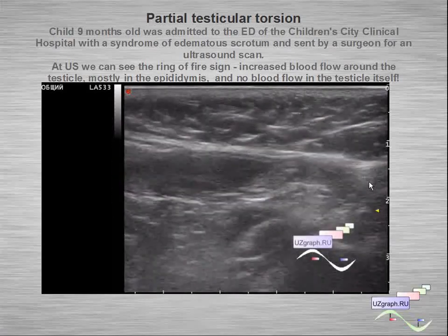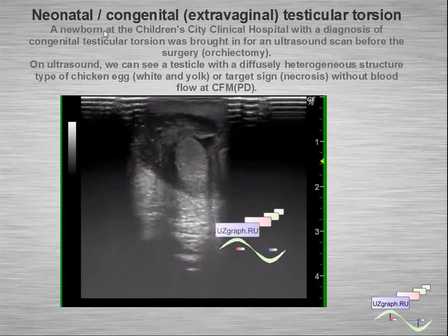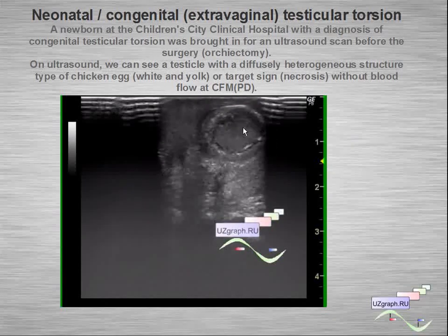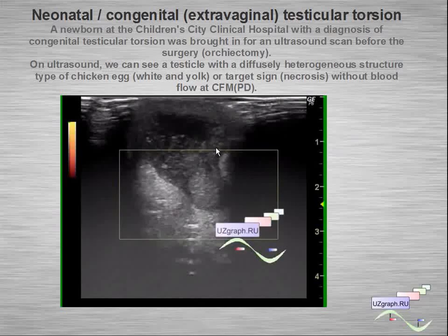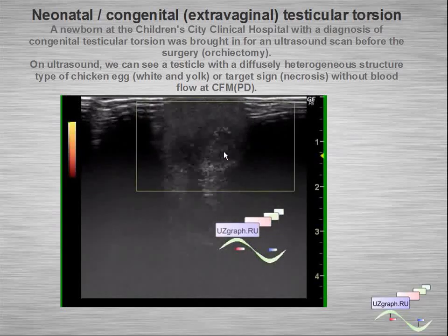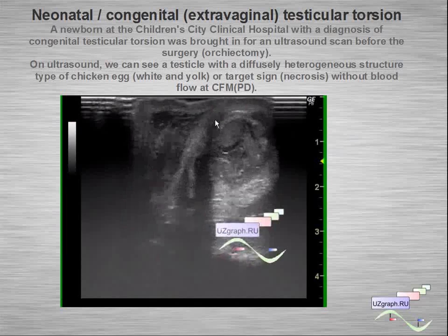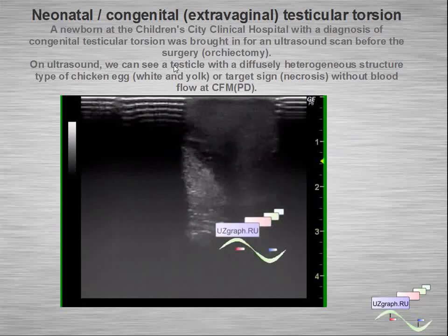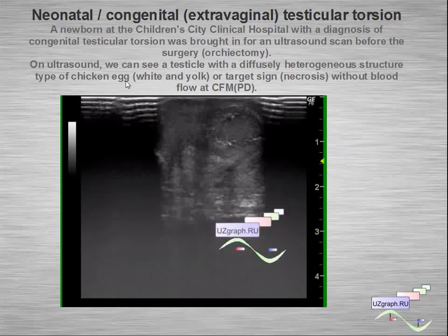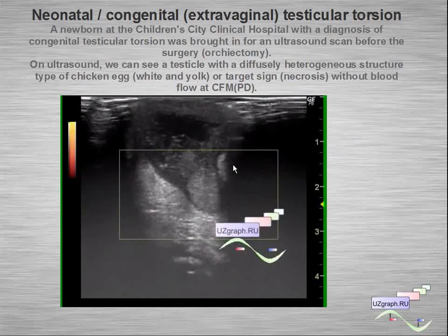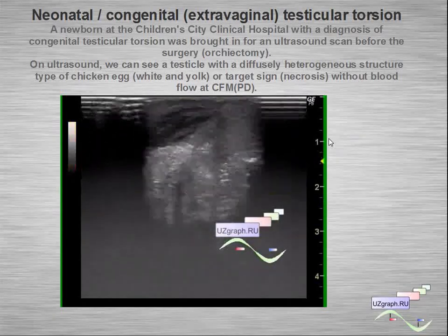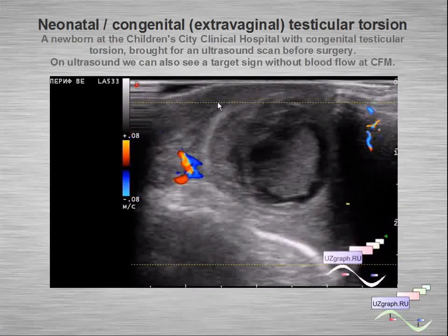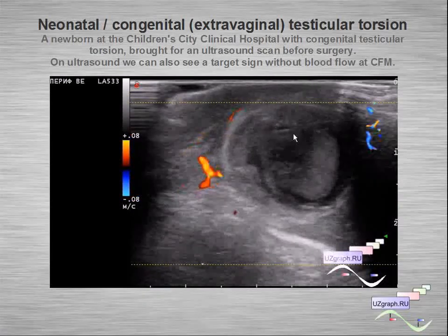Another example: neonatal or congenital extravaginal testicular torsion. We can see necrotic testicles with a chicken-egg appearance or target sign appearance, without blood flow at color flow mode. Another congenital testicular torsion with target sign, also without blood flow inside.